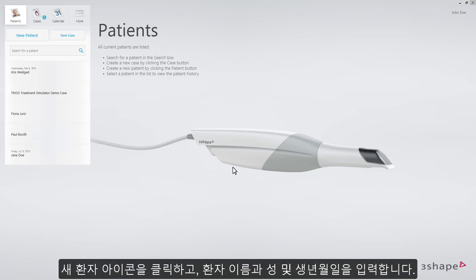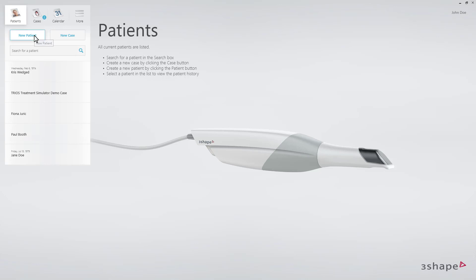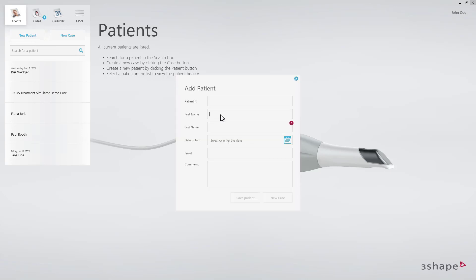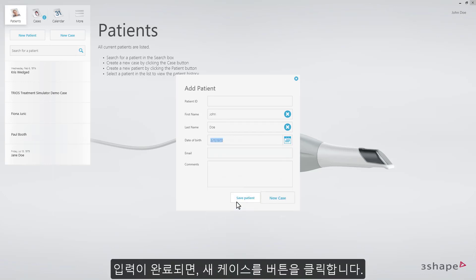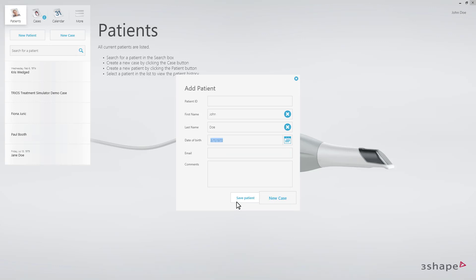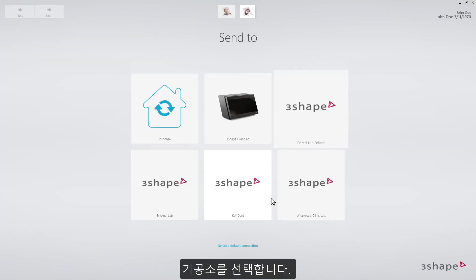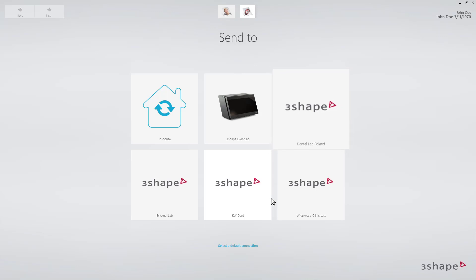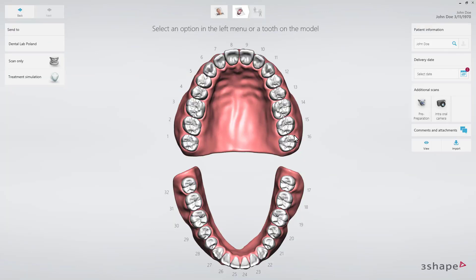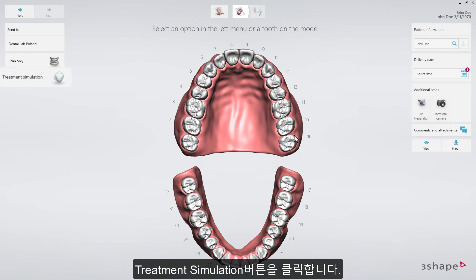Starting on the patient's page, fill in the patient name and the date of birth. Then click New Case. Select a lab. The order form will now appear. Select Treatment Simulation.